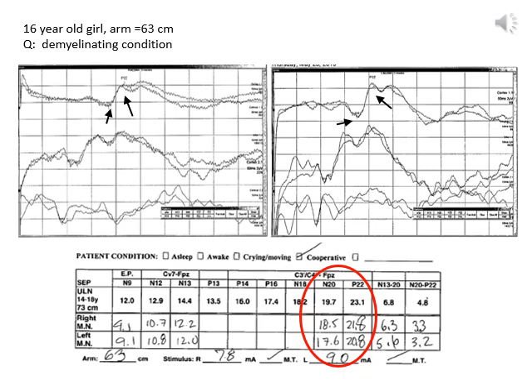Now looking to the right panel, for the N20, we'll see that there's a little negativity just before the prominent one. So there's actually an N18, N20 in this recording, but only the N20 values are noted by the technologist in the table below. And then there's a P22, which is quite clear and prominent, and so that number has been noted for us as well.